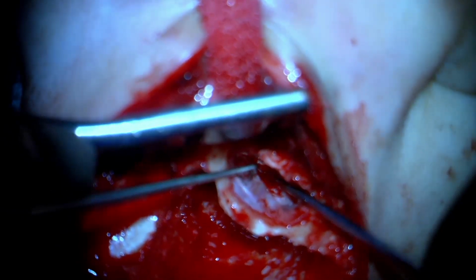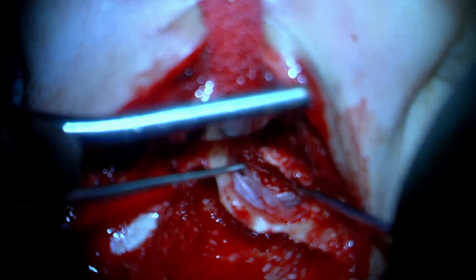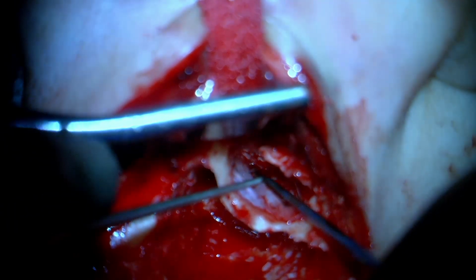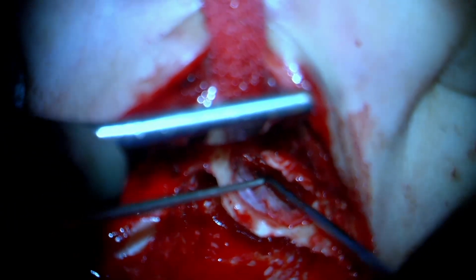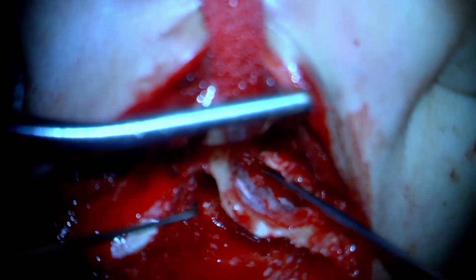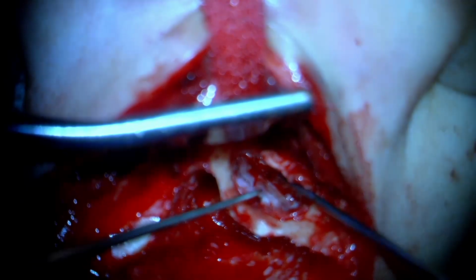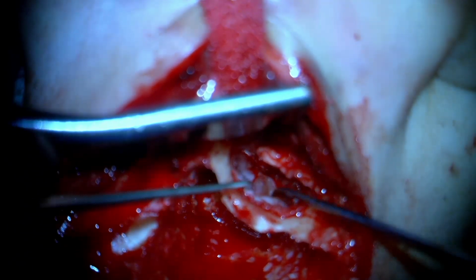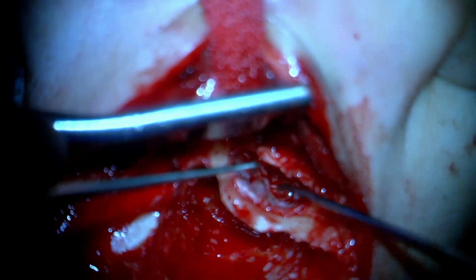Now see that the temporalis fascia has been nicely tucked and now covers both our cartilages as well as the new middle ear, which has been cleaned, over which we will rest our tympanomeatal flap, and that would finish off our procedure for this particular indication in young patients.